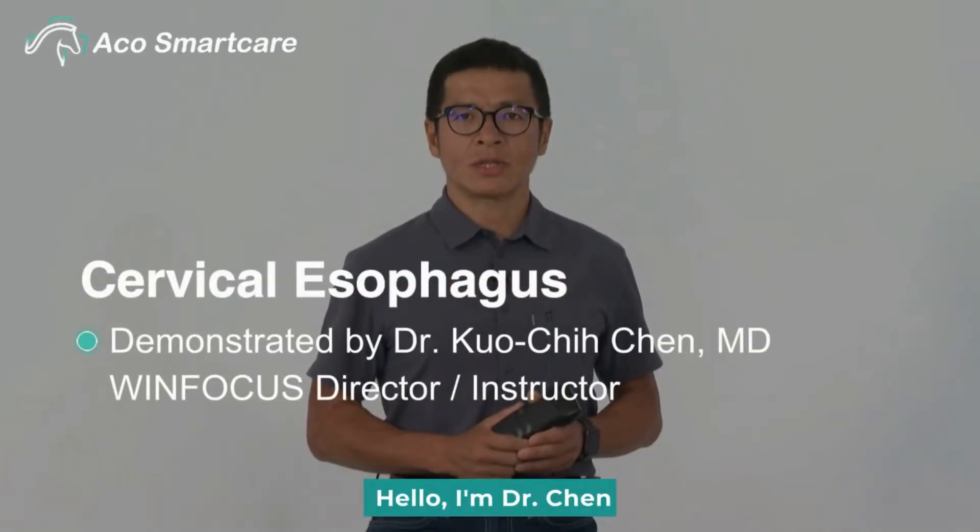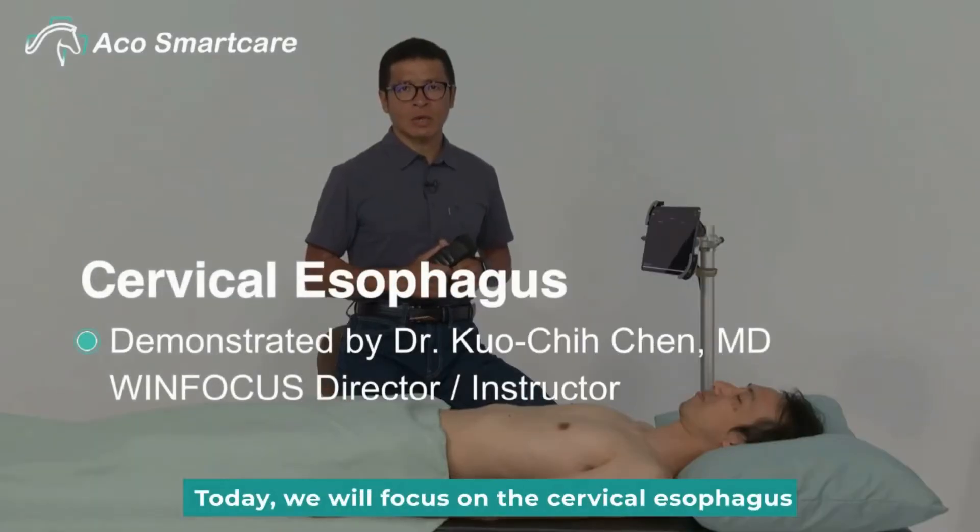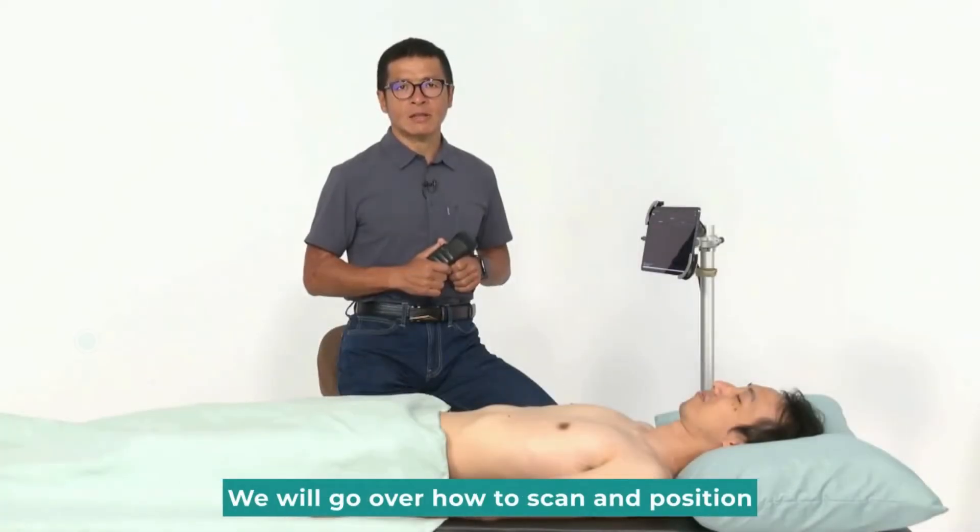Hello, I'm Dr. Chen. Today, we will focus on the cervical esophagus. We will go over how to scan and position.